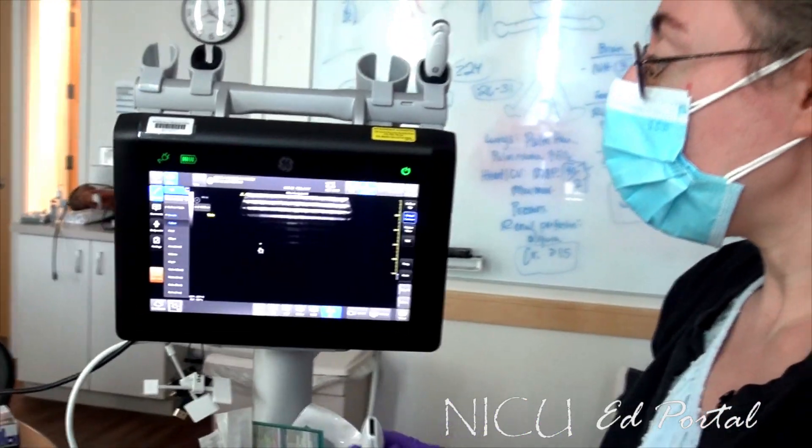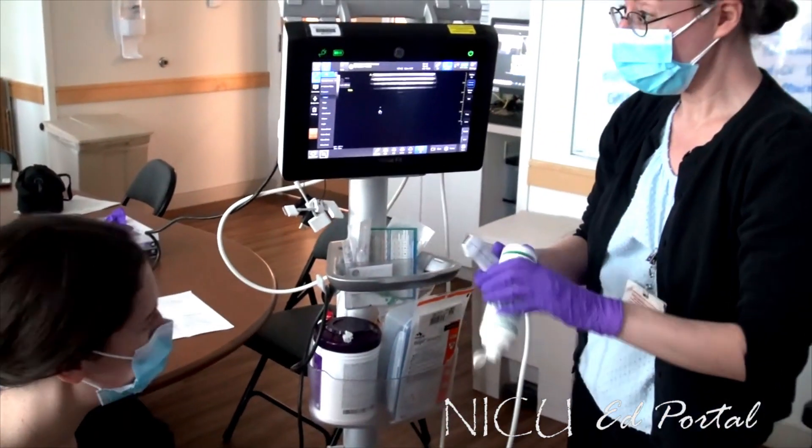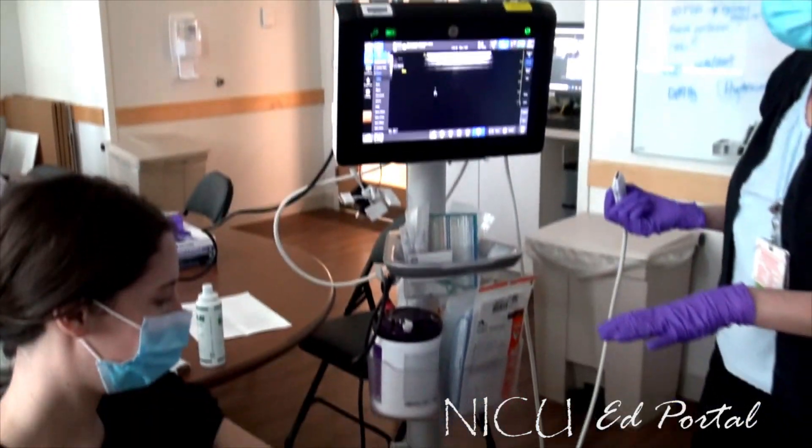Does anybody want to be our model patient? All right, so we're going to use plenty of gel to make sure we get rid of that air. We've verified that we have the correct patient.